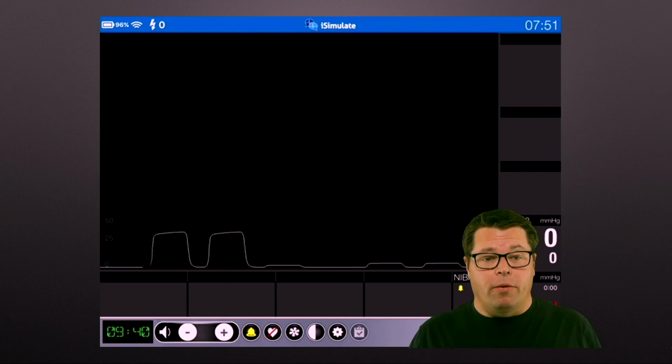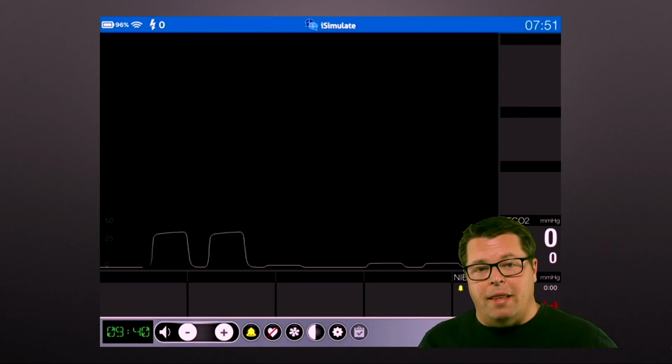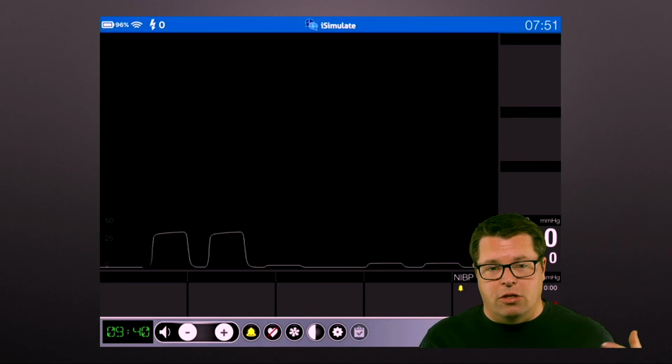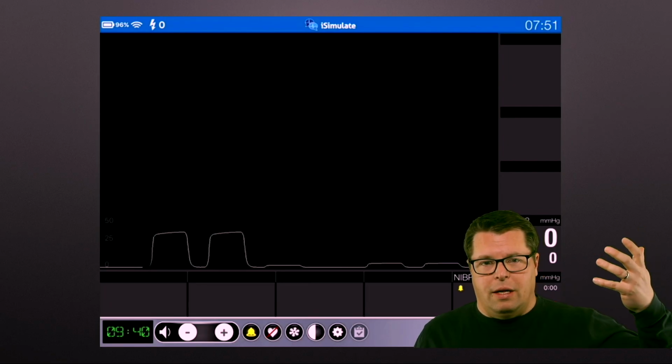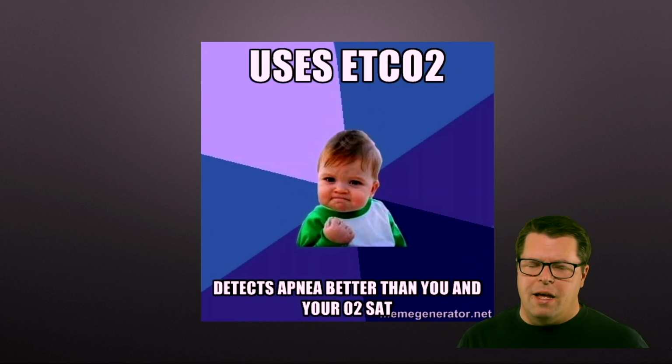And maybe we don't know that they're not trying to breathe, but for whatever reason, gas is not being picked up by that end tidal CO2 sensor, and we can't tell that it's being exchanged from the blood out through the airways. SpO2, the thing we say like, oh yeah, they're breathing fine. SpO2 doesn't really tell you that. It lags by a minute or two, often behind true hypoxia, the time when you actually stop exchanging gas.